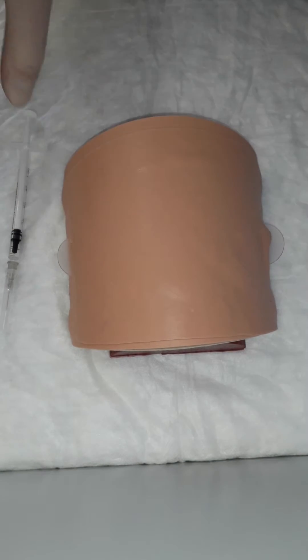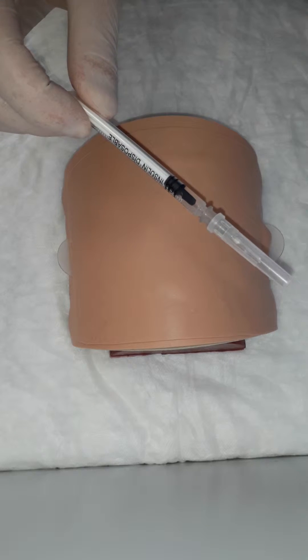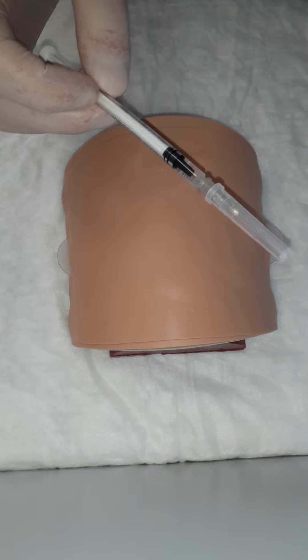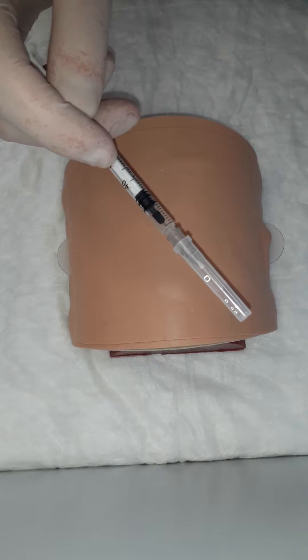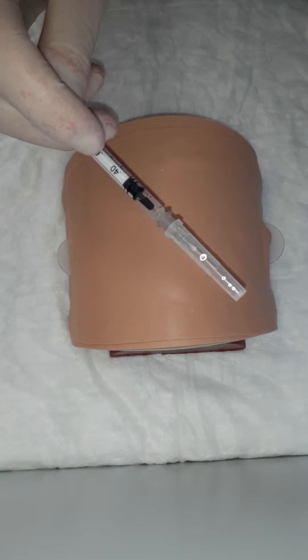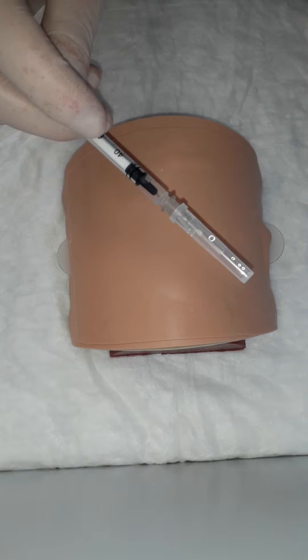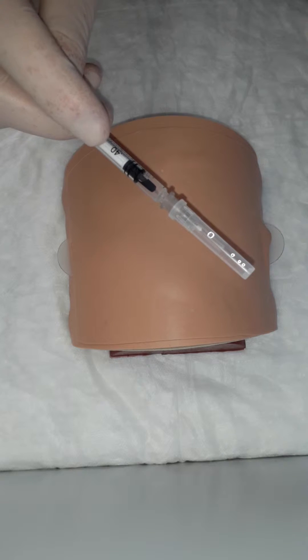Now we allow it to dry. Here is our syringe and needle. For intracutaneous injections, the syringe should be very small — just one milliliter. Don't take a 20 milliliter syringe because on a 20 milliliter syringe the smallest unit is one milliliter, and you can't give a precise dosage. For intracutaneous injections, you sometimes need 0.4 or 0.8 milliliters.